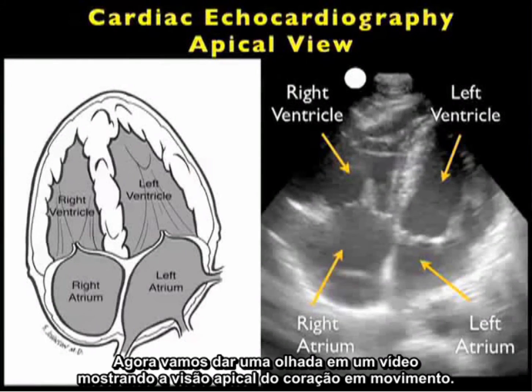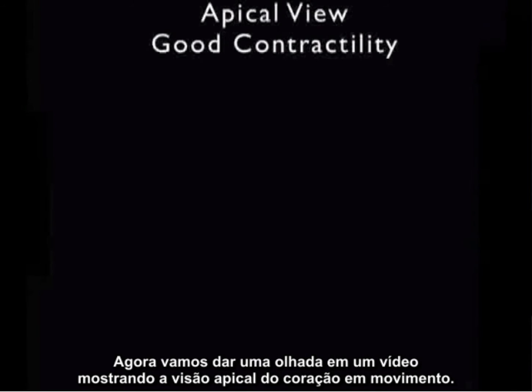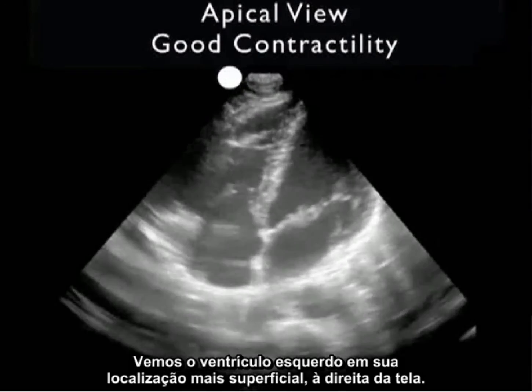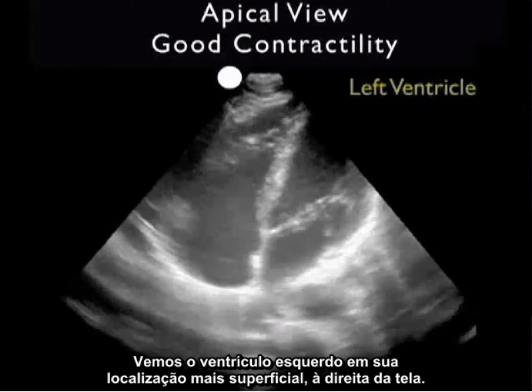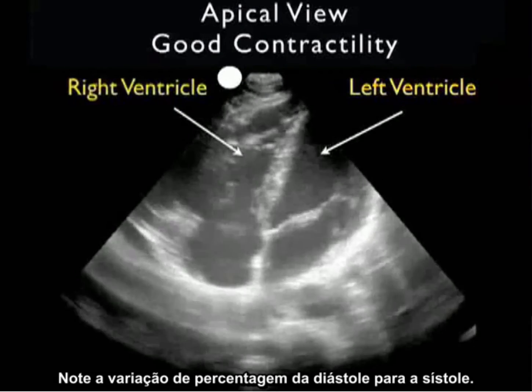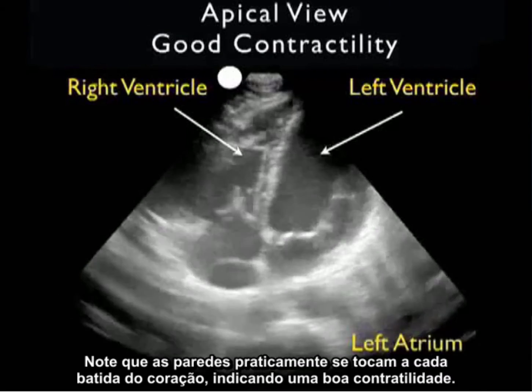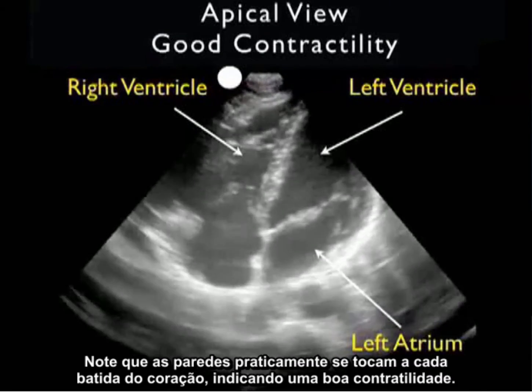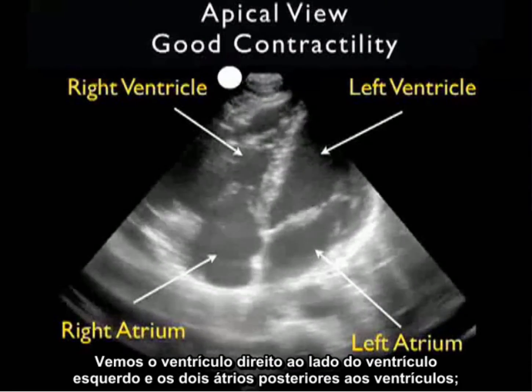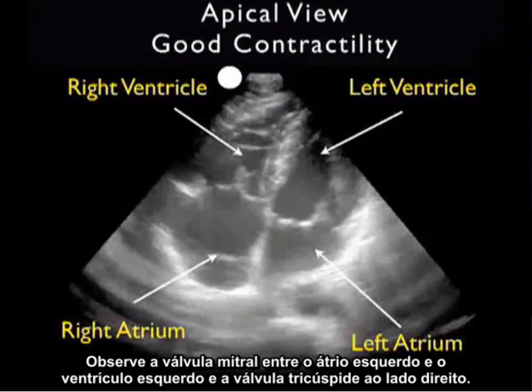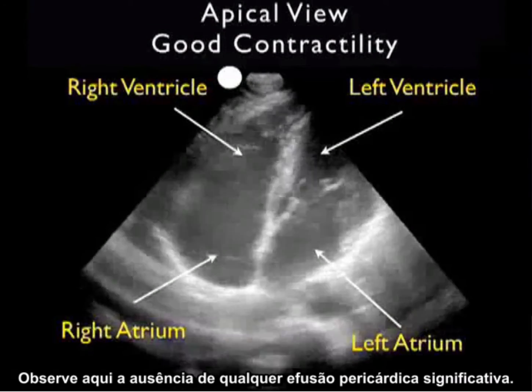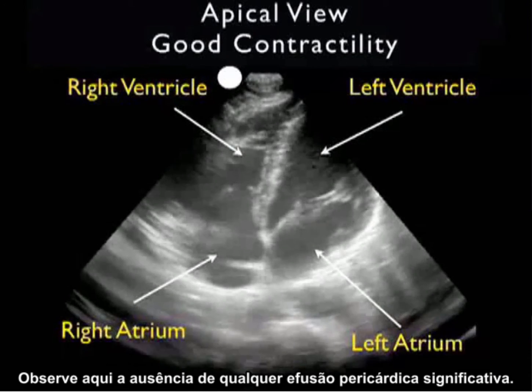Now let's take a look at a video clip showing the apical view of the heart in action. This is taken from a medical student triathlete. We see the left ventricle in its more superficial location to the right of the screen. Notice the percentage change from diastole to systole — the walls almost touch with each heartbeat, indicating good contractility. We see the right ventricle to the side of the left ventricle, and the two atria posterior to the ventricles. Notice the mitral valve between the left atrium and left ventricle, and the tricuspid valve to the right side. Notice the absence of any significant pericardial effusion.